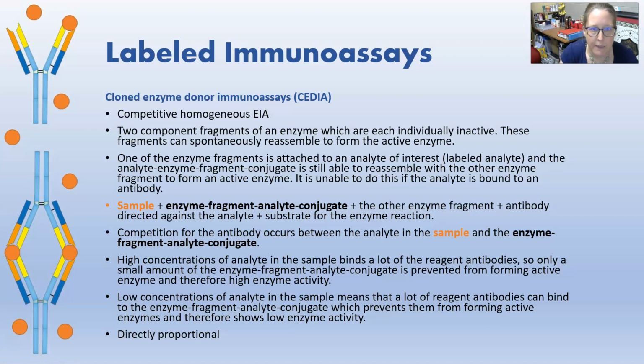Then you have CEDIA, cloned enzyme donor immunoassay. It is a competitive homogeneous immunoassay. Two component fragments of an enzyme, which are each individually inactive, are in the reagents. These fragments can spontaneously reassemble to form the active enzyme.